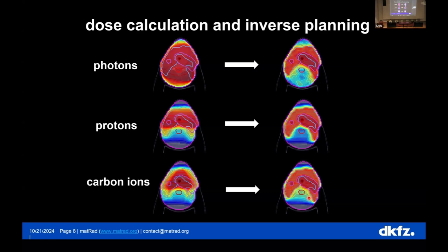The most accurate and most extensive way is to solve this equation by doing Monte Carlo simulations. Monte Carlo is also a way to solve an integro-differential equation. Or you solve the equation with other mathematical methods, like the Acuros solver, which does radiation transport by solving the differential equation directly with some tools you also know for differential equation solving maybe.